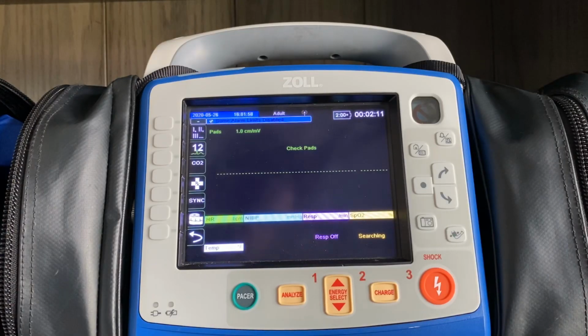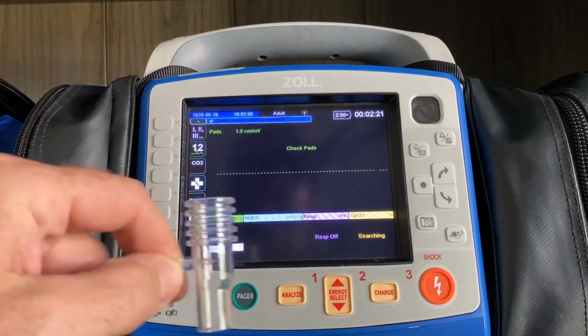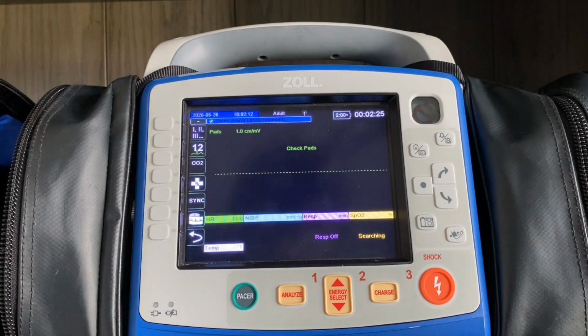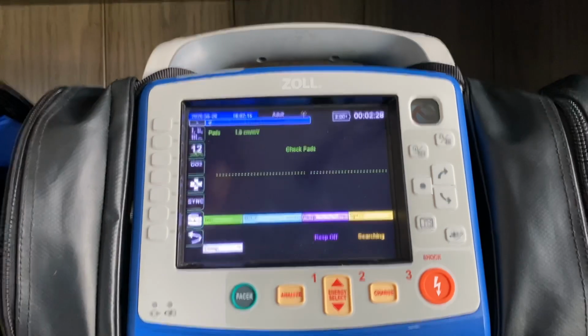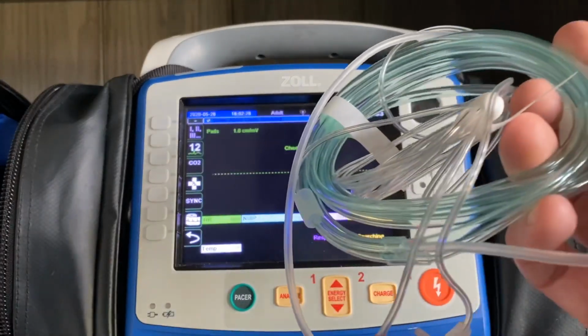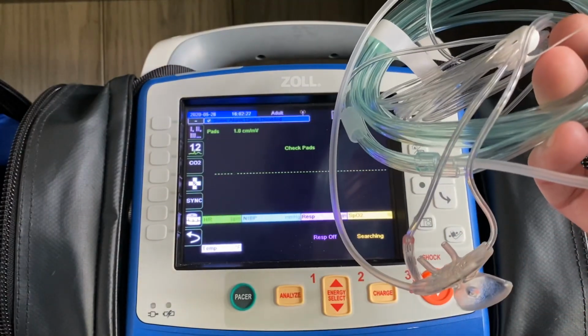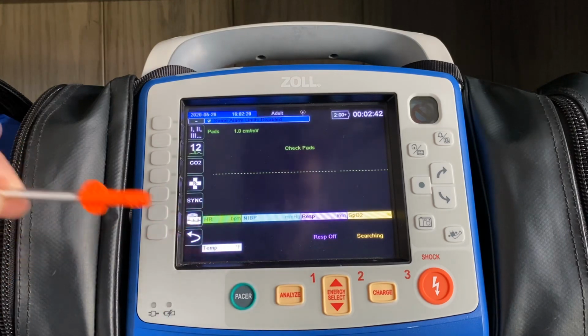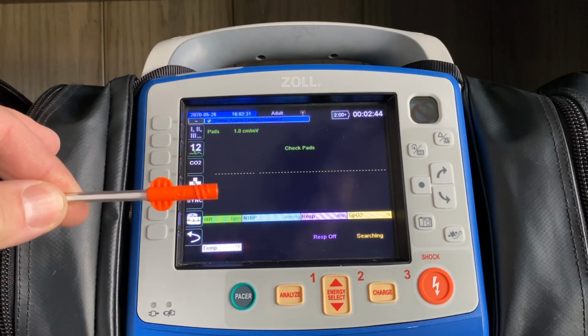All right, so the first thing we want to review is just the general functionality of capnography on the ZOLL X Series. So whether you're using an inline adapter for your cardiac arrest and vent patients, or you have the oral nasal cannula for your respiratory distress patients, both of those disposable pieces will have this orange plug-in, which gets plugged into the left-hand side of the device.